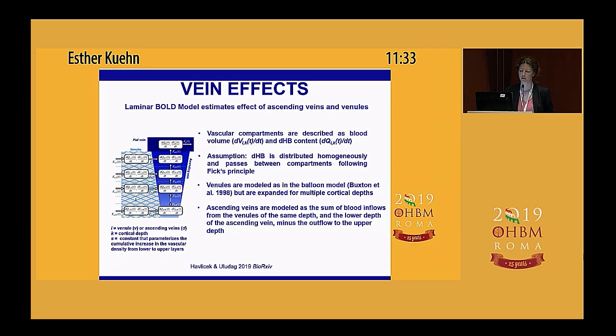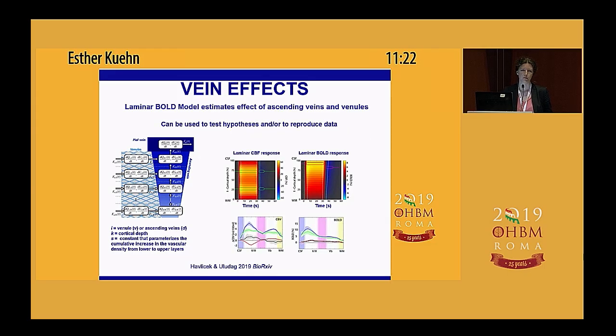What I just want to show you here today is that this model is really trying to model the contributions of each of those different blood vessels on your data, which then allows you, for example, to test different assumptions, but also to validate your data.